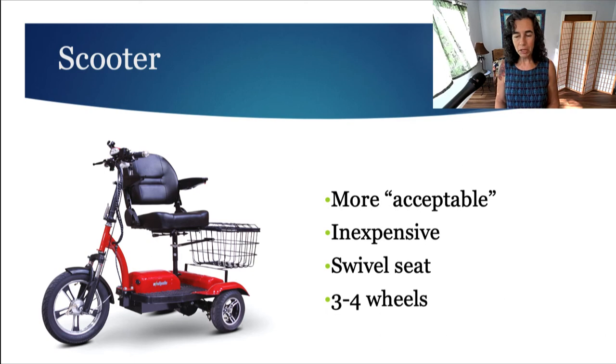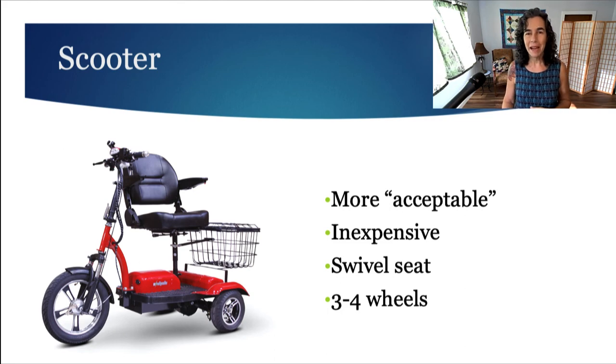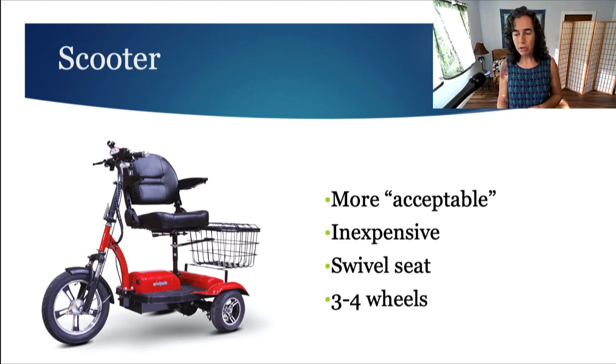They need a specialized lift on the back to put it into a van. So the mobility options for the device need to be worked out, and you need to have fairly good upper extremity function and strength to operate them.